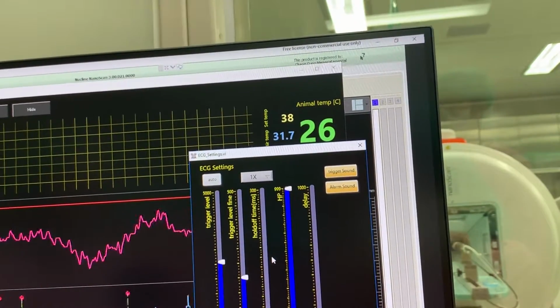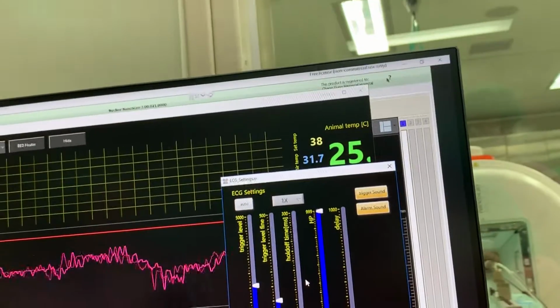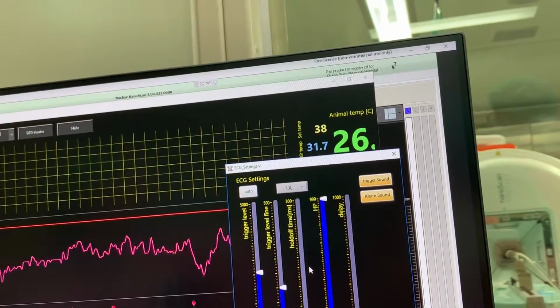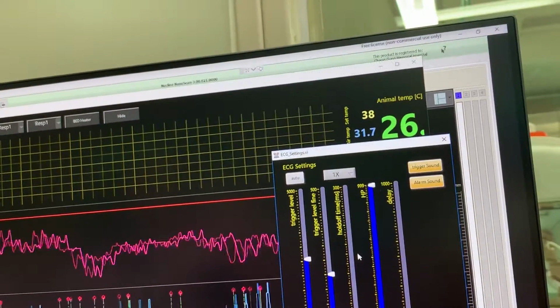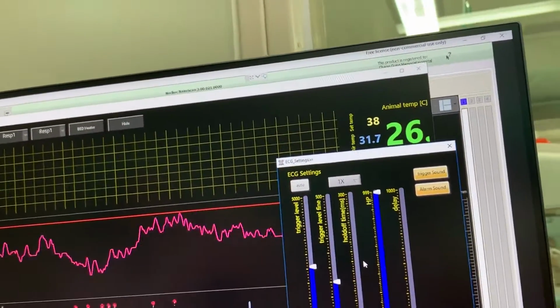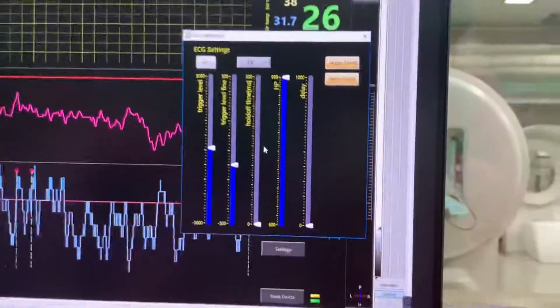there is a peak which could have been considered by the system as a trigger signal, because of the hold off setup, the system will skip it. So it's useful if you have, for some reason, a noisy signal, and you see that not all the peaks belong to a real heartbeat.